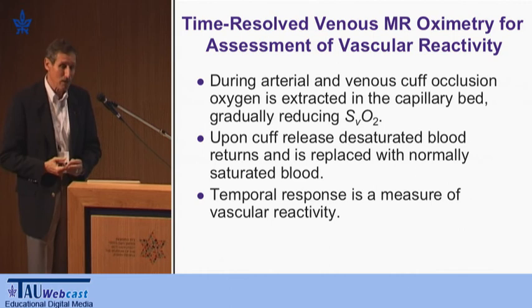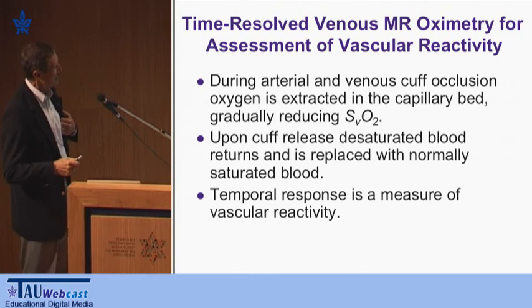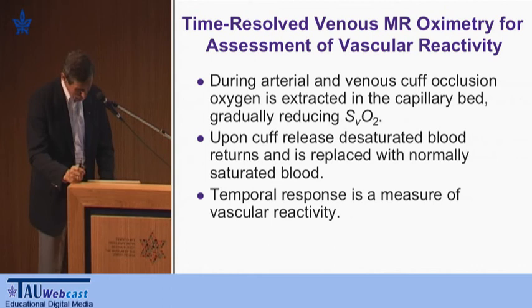Of course, that is not really so interesting because we know that these people are sick and there are other means to study them. We are more interested in early atherogenesis, like endothelial dysfunction. For example, comparing young smokers to non-smokers. And once you've seen the results, you probably don't want to smoke anymore.